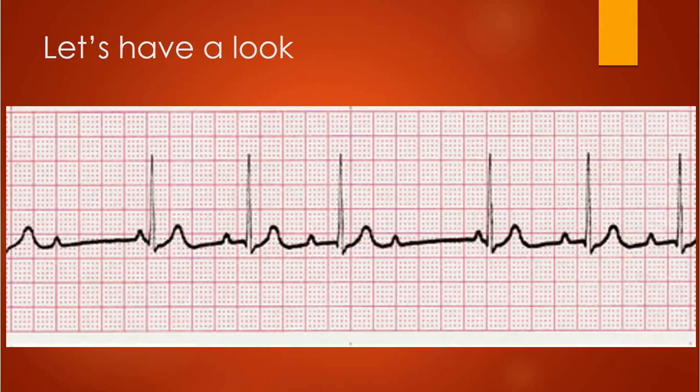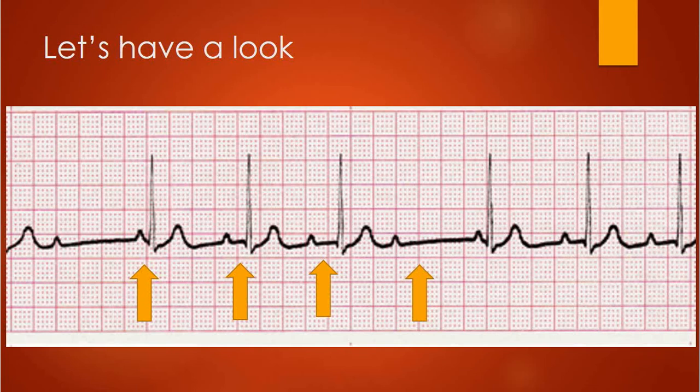So let's have a look at one. When we analyze the PR interval, as you can see here, it elongates, it elongates, and then it drops a complex. We have a P wave with no QRS complex following right behind it — classic Wenckebach block right here.